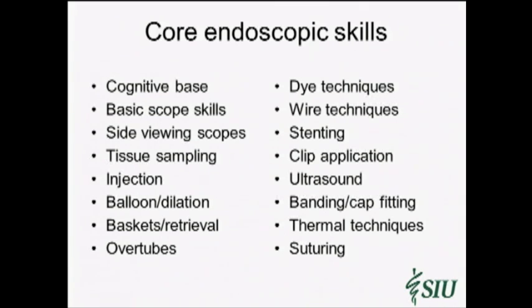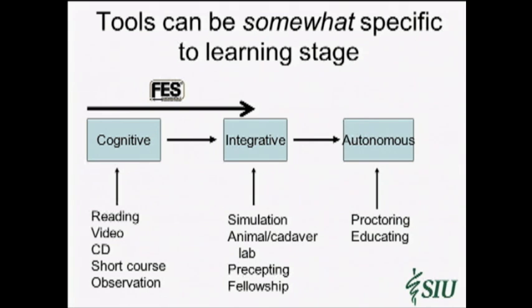in order to be a really well-trained beginning endoscopist. So if I take Kopta's model, again, thinking as an educator, and look at the sequence, and ask what steps in the process could best be addressed with different learning tools, and I've outlined those at the bottom of the slide for each of these steps that Kopta has given us. I think you'll see that FES really offers the potential to strongly leverage the beginning part of this curve, and not just with tools, but with validated tools, as you've heard, I think, repeatedly through this program this morning.